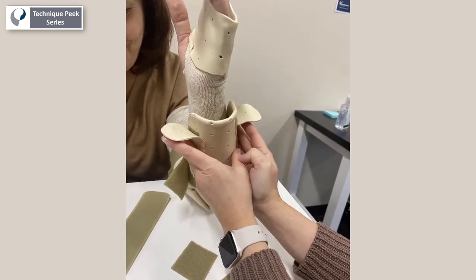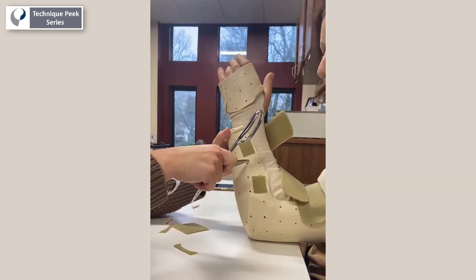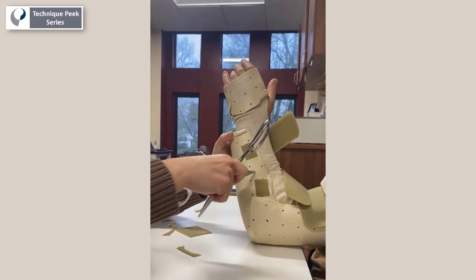Fishing line will be used to create the dynamic component. We will need to create two wing pieces through which the wire will pass.